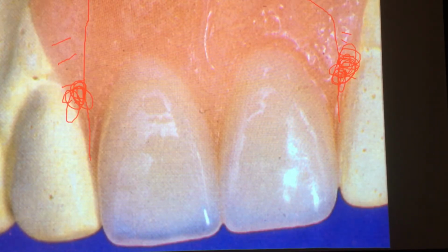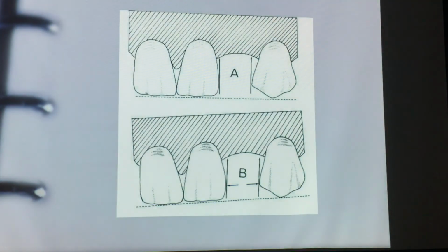And by shaving these guide planes, we could minimize those unsightly black holes there, which I think you agreed that you had on your acrylic partials on 1 or 2 of them last year. So we're going to evaluate aesthetics. Back to our lateral. Is it better A or B? We decide which one's going to minimize these kind of problem zones in here and in here, and which one is more in the smile zone, the mesial cervical third or the distal cervical third, depending on the smile line.